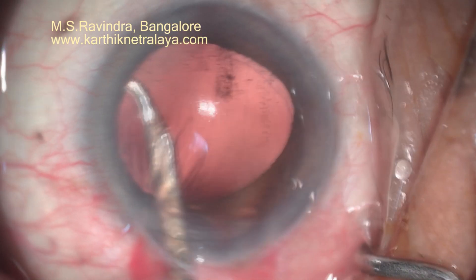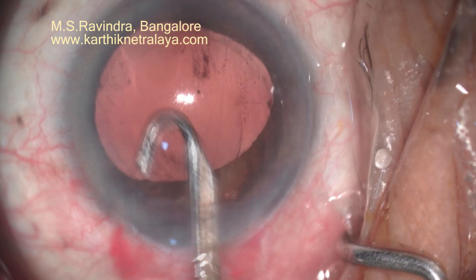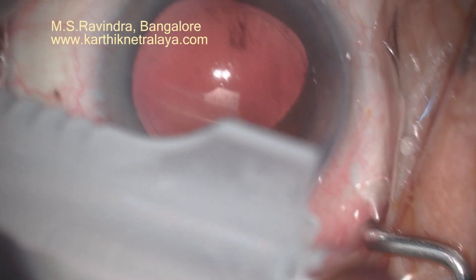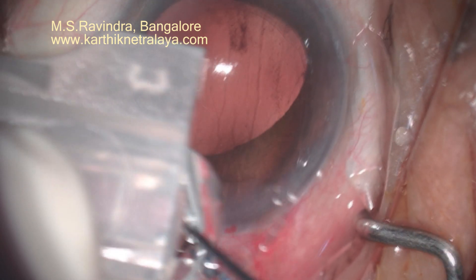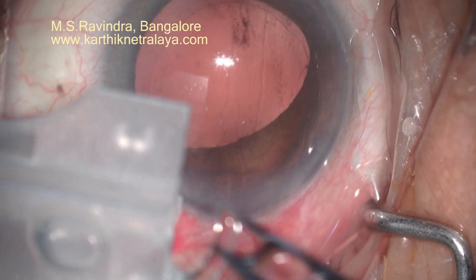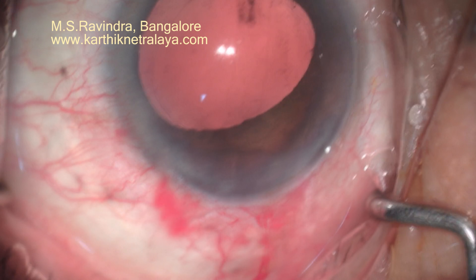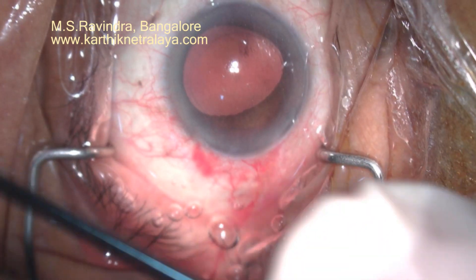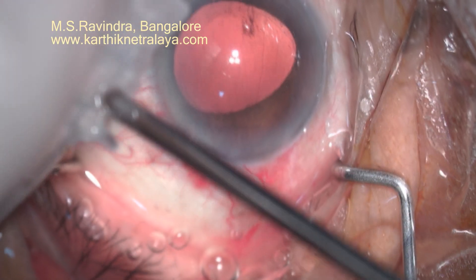The cartridge is filled with viscoelastic. The lens is first dipped in viscoelastic, then the haptics are folded in front of the lens in the conventional way. Instead of using the injector, I am using a 16-gauge rod which I slide along the floor of the cartridge so that the lens is injected. It is a very smooth technique — the lens is not folded at all. There is a slit in the cartridge top which reduces damage to the lens.